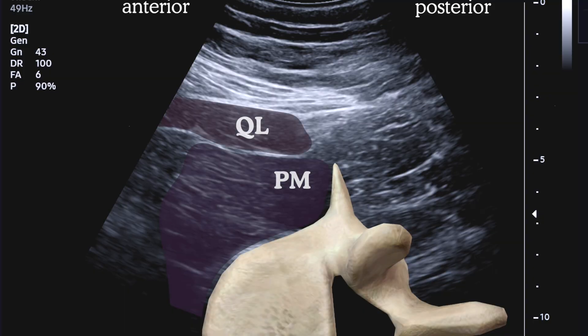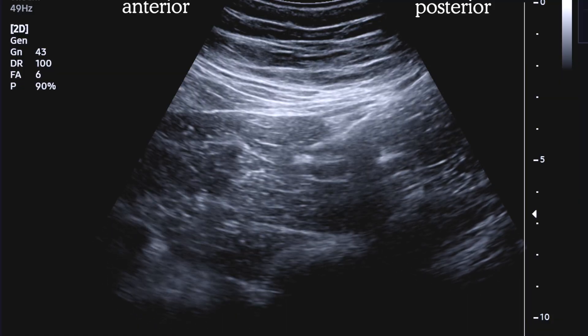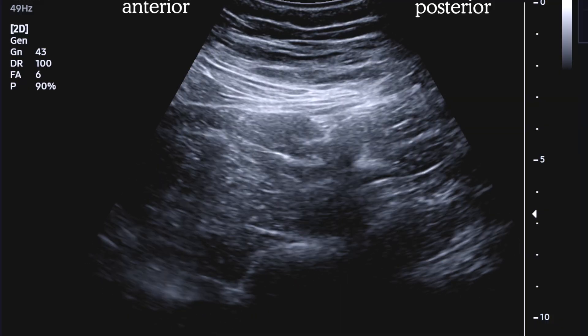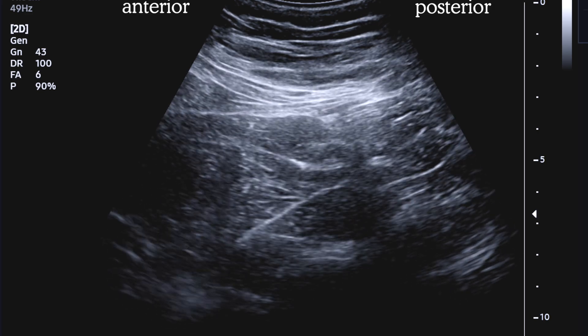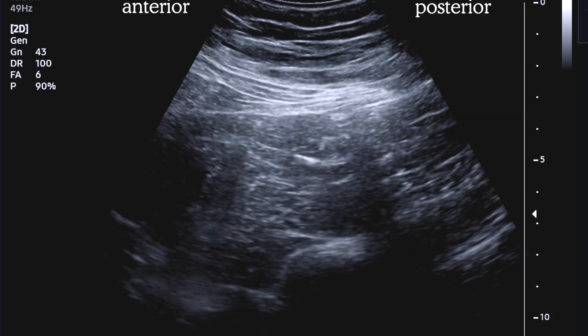Here we see our paraspinal image with the shadow of the L3 vertebra and the QL and psoas muscles. There's a bright streak here within the psoas that might be the lumbar plexus. We insert the needle and quickly see that it's too shallow — we're up in the plane between QL and psoas. Great for a QL block, but not today. Let's withdraw and try again. On the next pass, we get into what feels and looks like the right plane, but we're not getting any motor response from the femoral nerve, so it's not reassuring. Let's aim a little more medial.